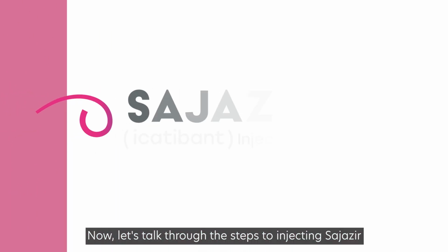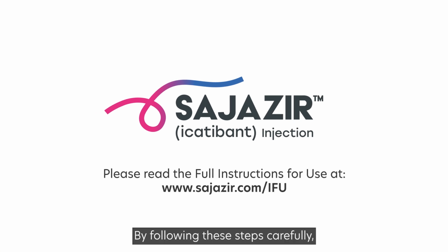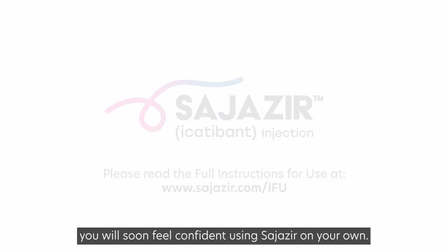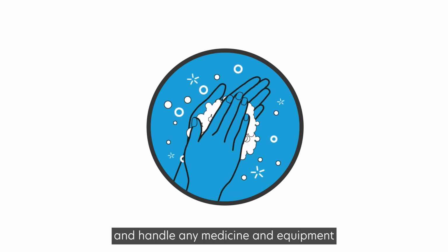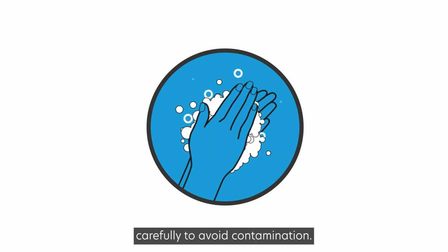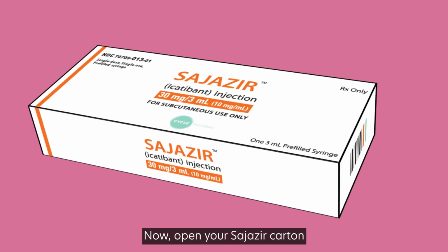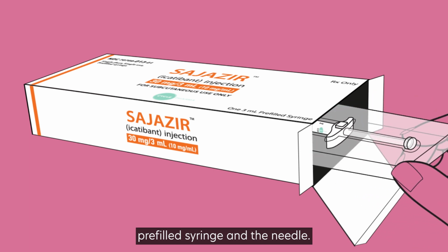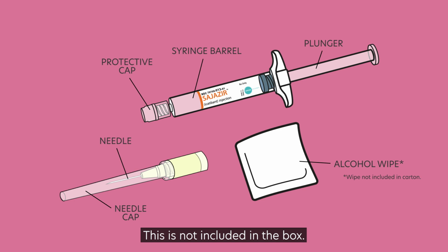Now, let's talk through the steps to injecting SAJAZIR one by one. By following these steps carefully, you will soon feel confident using SAJAZIR on your own. Before you get started, wash your hands with soap and water and handle any medicine and equipment carefully to avoid contamination. Now, open your SAJAZIR carton and remove the single-use pre-filled syringe and the needle. You're also going to need an alcohol wipe. This is not included in the box.